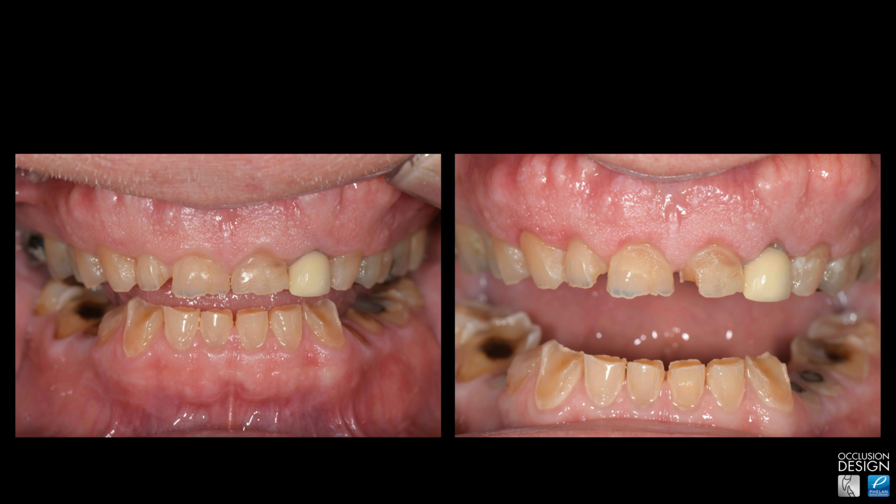This is for a super patient, a real nice guy who was suffering from some severe erosion and tooth wear, to the point where a couple of lower bicuspids were eroded right to the gum line and needed to be extracted. So let me share with you this case.